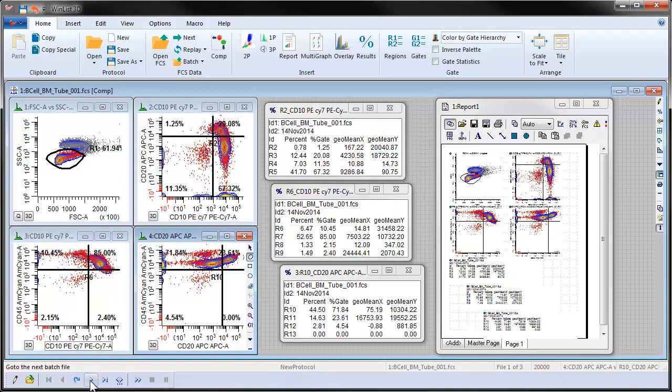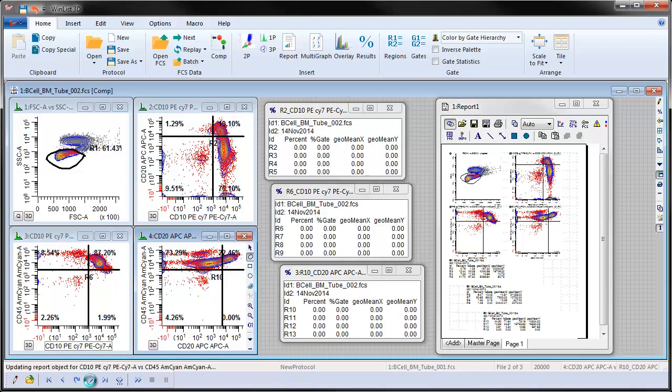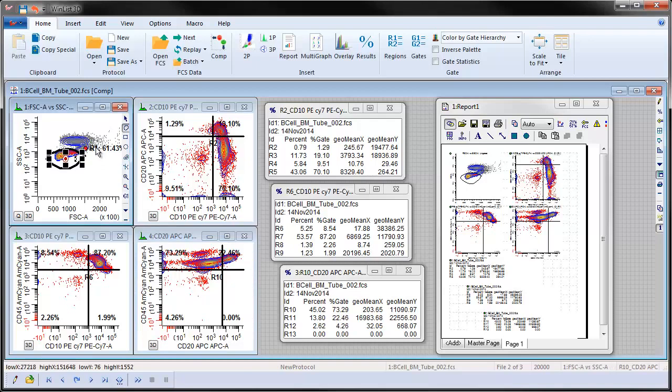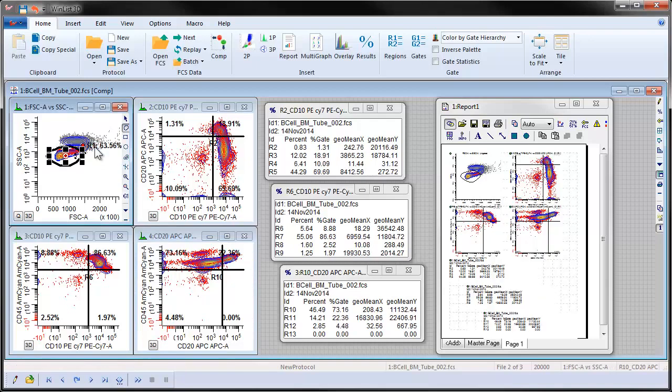Click the Next Batch Item button on the Batch toolbar to advance to the next List Mode file. At that point, we can adjust the regions and graphics and statistics will be updated in the workspace and on the report.